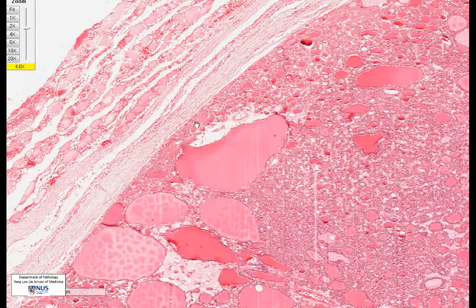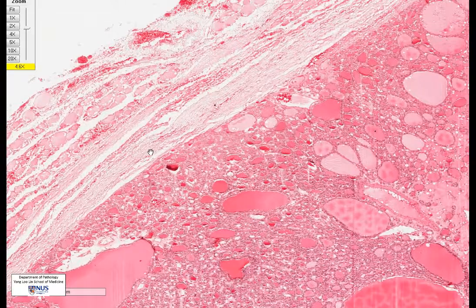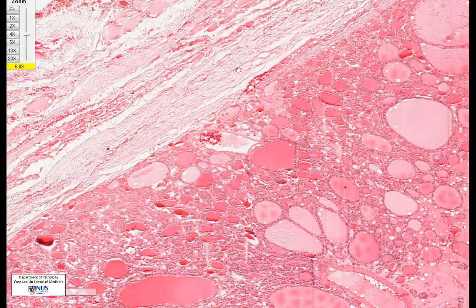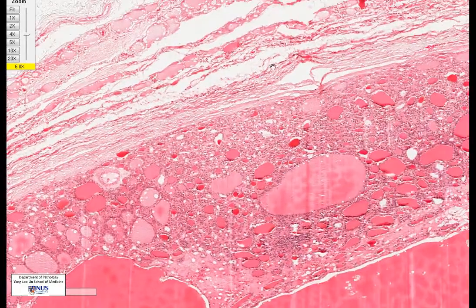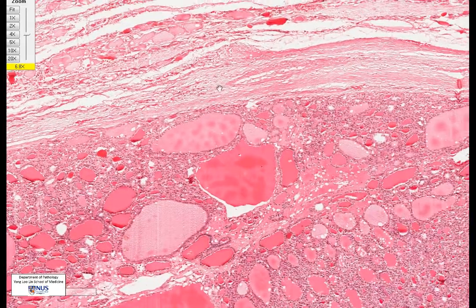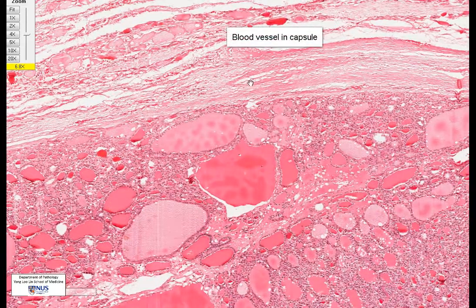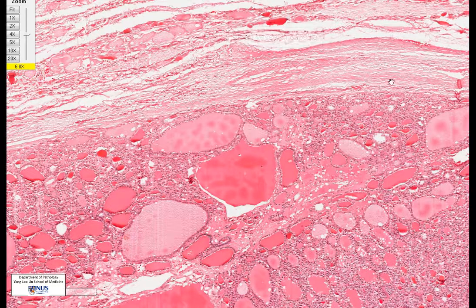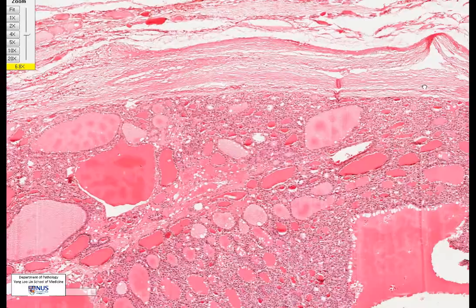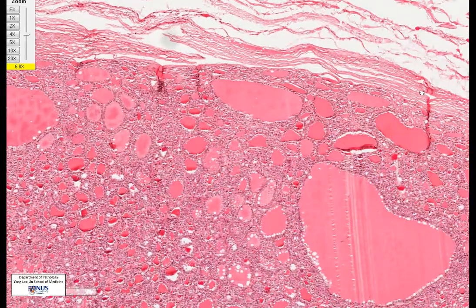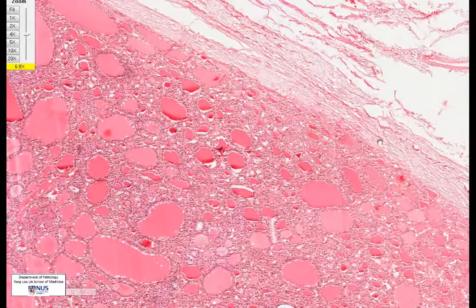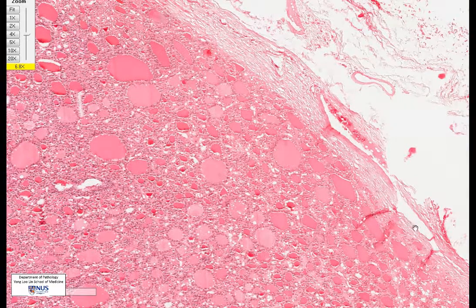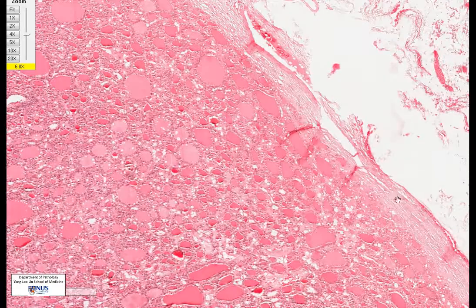Here is the fibrous capsule — I'm going to trace it as we go through. We can see that it is intact and there are no areas poking out or invading into the capsule. Here is a vessel within the capsule; if this were a follicular carcinoma, we may see tumor sitting inside this vascular space, but we don't see it here. As we follow along, the capsule appears nice and intact with no areas of capsular invasion. Here we have another vascular space, but there is no evidence of vascular invasion.